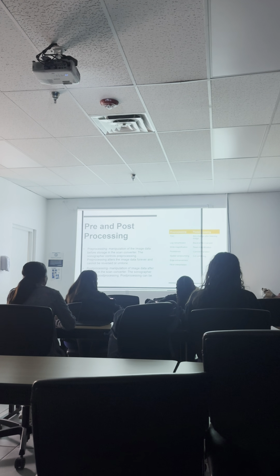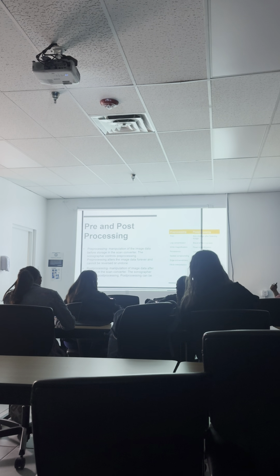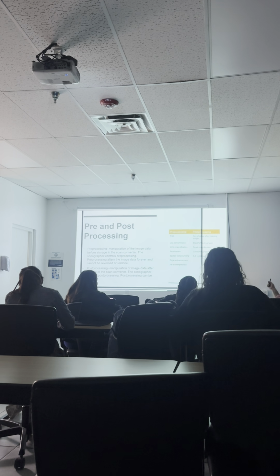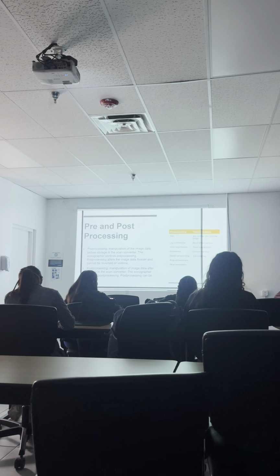Okay, you guys know what 4D is? It's a video of the 3D image. So 4D is 3D but live. So every machine has 4D. When they say we have 4D machines, everybody has 4D machines. Is it a big difference from 3D to 4D?